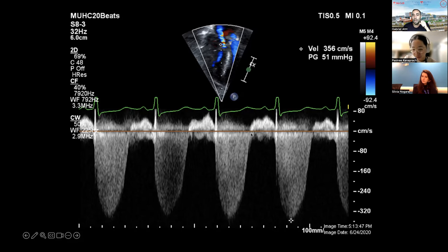So you could also measure a marker that we call systolic to diastolic time ratio. This is one cardiac cycle, and in the cardiac cycle, you get a portion in systole and a portion in diastole. And you can see here, you're not spending 1/3 of your time in systole and 2/3 in diastole. In this particular patient, actually, they're spending more time in systole. And we know that kids who have more RV dysfunction spend more time in systole. Same thing for LV. As your LV becomes more dysfunctional, you need more time to empty it. So your systolic to diastolic time ratio is going to increase.